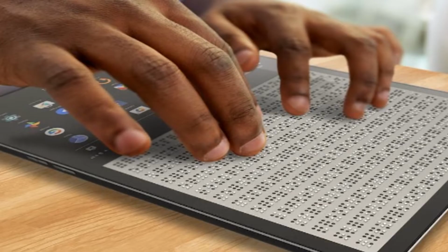Welcome students. In this session, we are going to learn about Braille devices and its types, description and relevance. Nowadays, there are a number of electronic devices available for students with visual impairment with advances in technology.